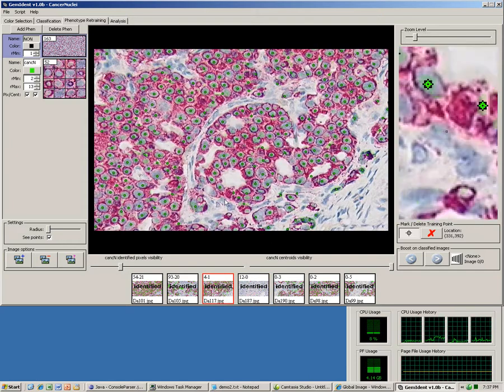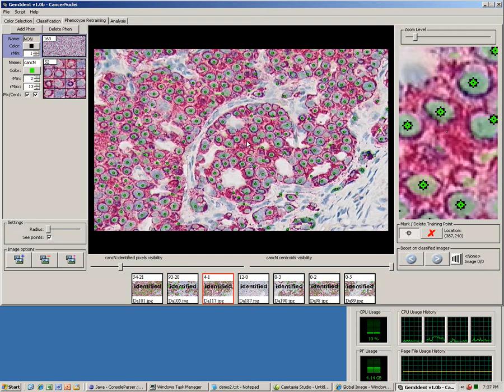You get the idea. A good classification may take many cycles of training, classifying, retraining, reclassifying. It all depends on the application and the accuracy desired. When confident, a full classification of all images in the set can take place.